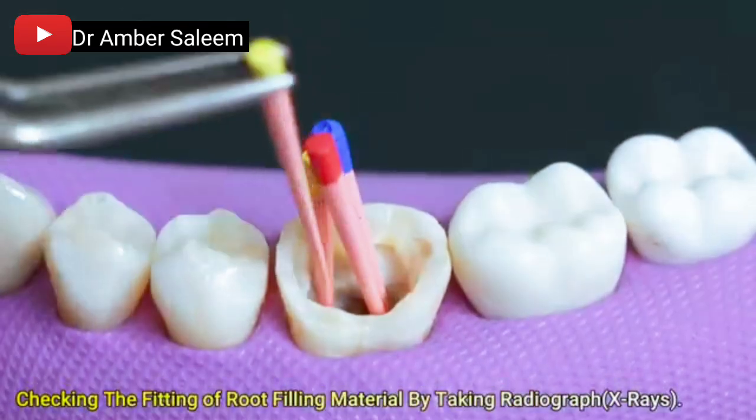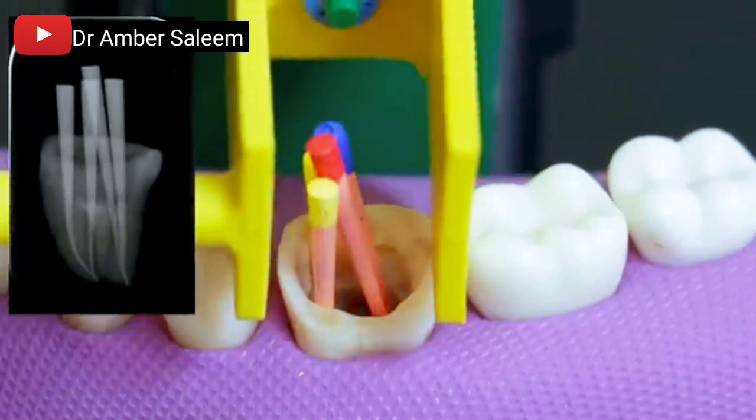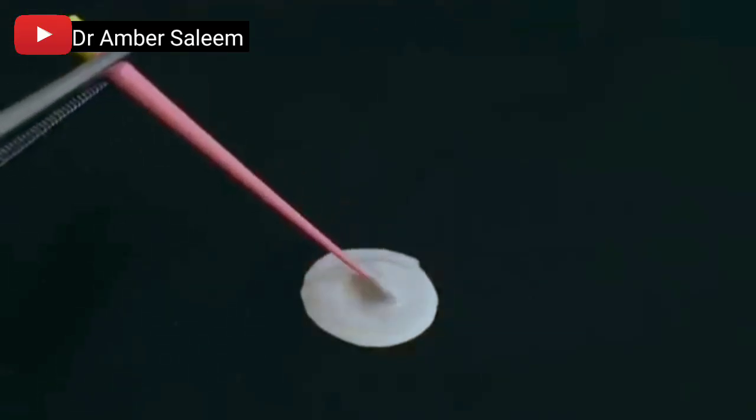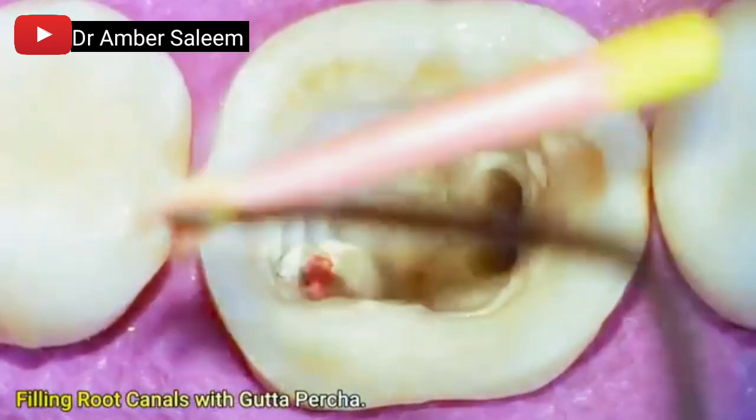Checking the fitting of root filling material by taking a radiograph. Root canals are then filled with gutta-percha via the obturation technique to seal the prepared canal space.